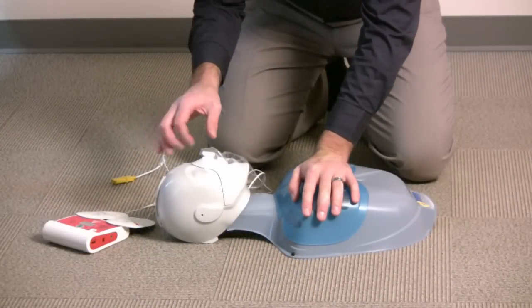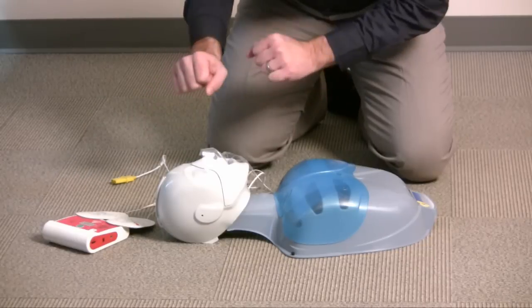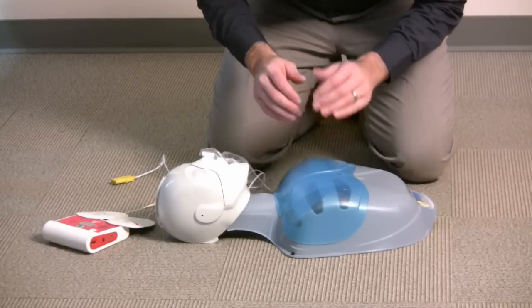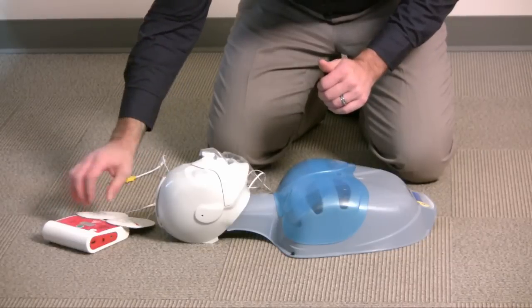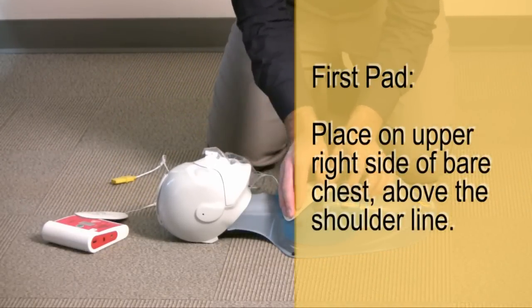So I've been performing CPR and someone has come along and brought me an AED. Now, as a first aider, one of the most important things you need to remember to do with an AED is make sure your pads are placed on the chest properly. If the pads are not in the right spots, you're not going to get a proper current passing through the heart.